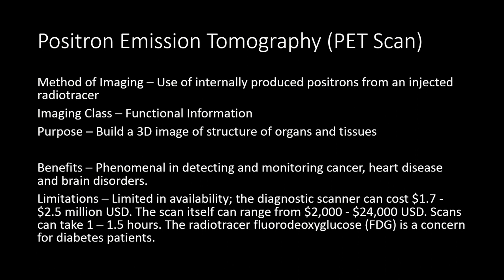Again, as that fluorodeoxyglucose is breaking down, it is releasing positrons, high energy electrons that have a positive charge, which can be detected by the scanner.